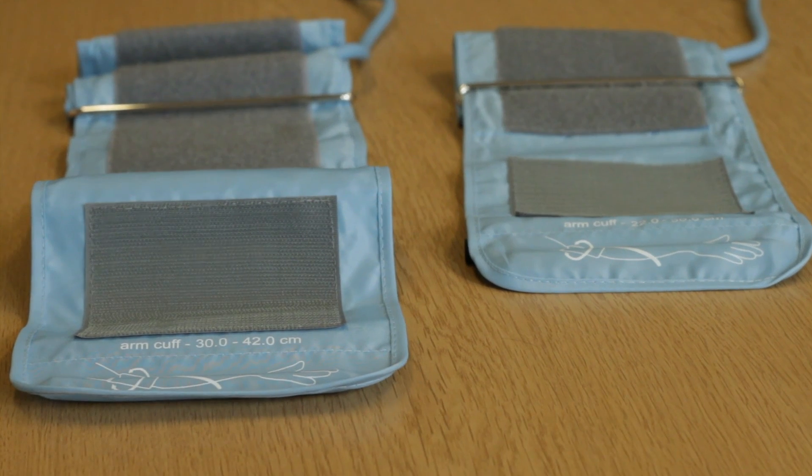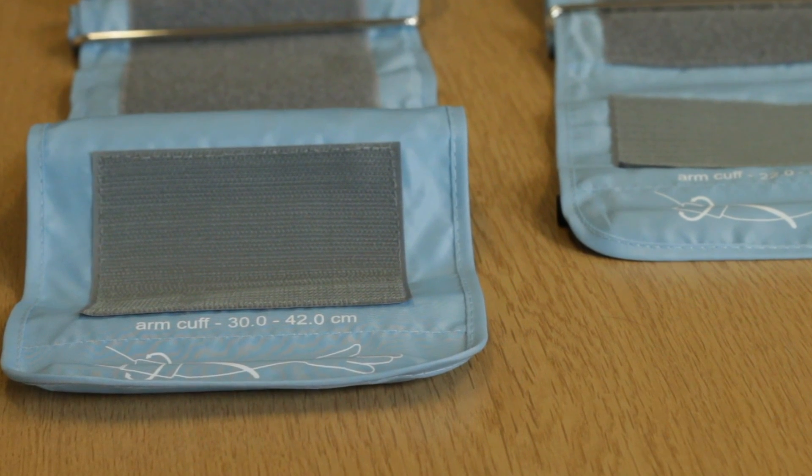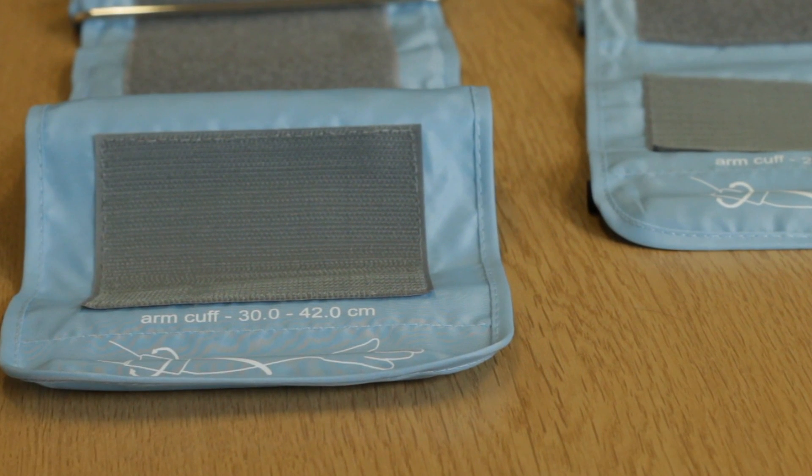Before undertaking any tests, ensure that you have the correct cuff for the size of your arm. The Kinetic Blood Pressure Monitor comes complete with a standard sized cuff, suitable for most arm sizes.